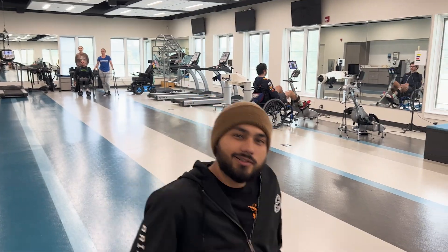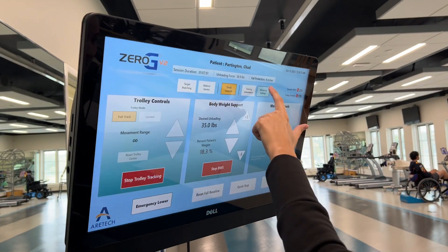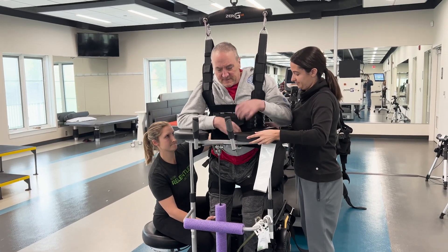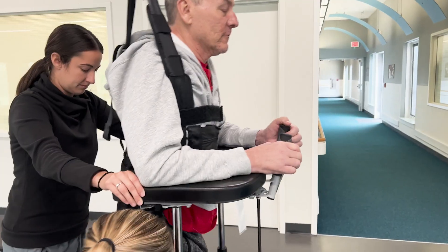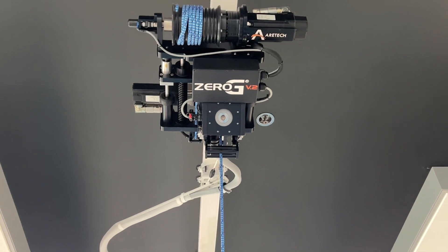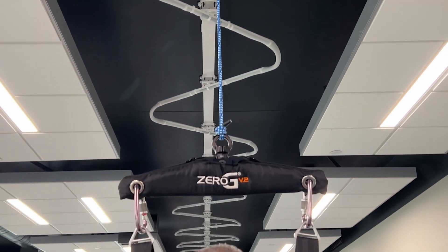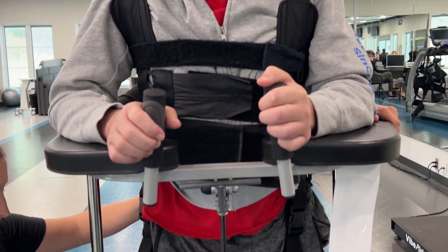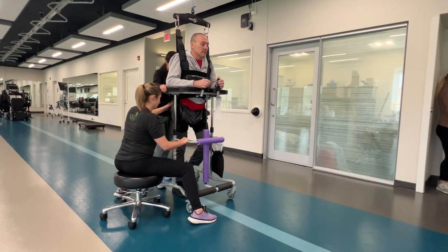Let's check out the Zero-G. Hi everyone, I'm Sammy, a PT here at QLI. Hi, I'm Chad, a resident here at QLI. This is the Zero-G — it's our bodyweight support system and it allows us to practice safe walking and transfers without the risk of a fall. It also lets us accommodate someone if they're more successful walking with bodyweight support offloaded, and it allows us to transition to more independence. This Zero-G is going to help me get back to walking independently and living more independently.